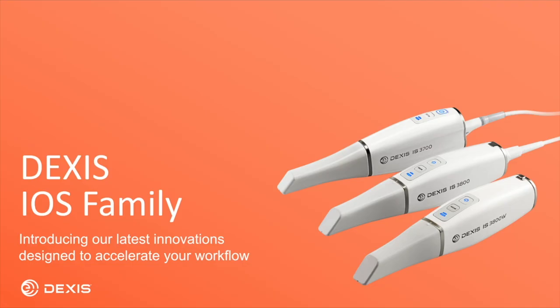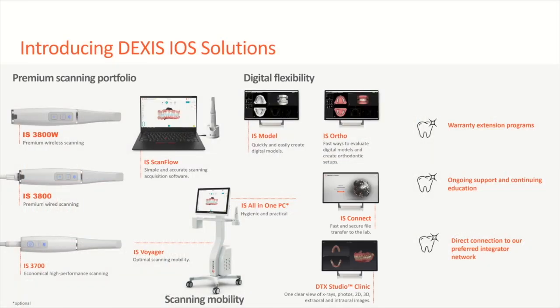Okay, so let's start with the introduction of our portfolio. Currently we offer 3 intraoral scanners, 2 premium ones, which are characterized by high quality scans and scanning speed. Here we have IS 3800W, which is a wireless scanner, and IS 3800, which is a very light wired option. Apart from that, we have an economical option, IS 3700, which is our older proposition. Our scanners can work with a laptop or with an all-in-one PC together with our trolley, which is IS Voyager, and it's up to the user's decision which option they would like to choose.